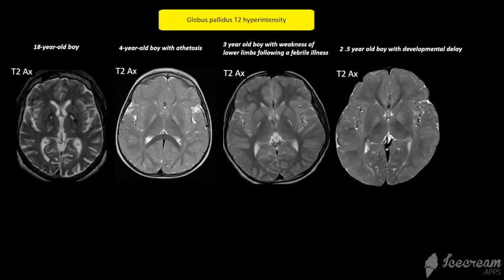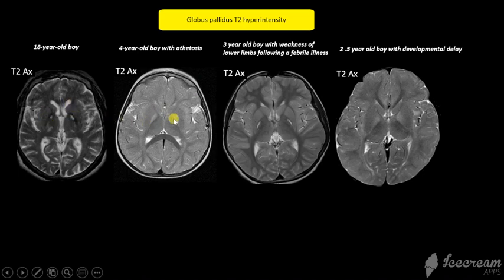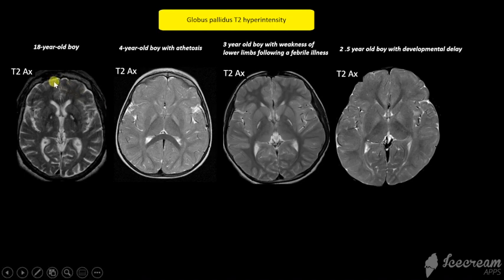These are four different cases all with similar findings of hyperintense globus pallidus on T2. History is useful in many of these cases. This first case had a history of remote fire accident, so these changes are compatible with carbon monoxide poisoning.